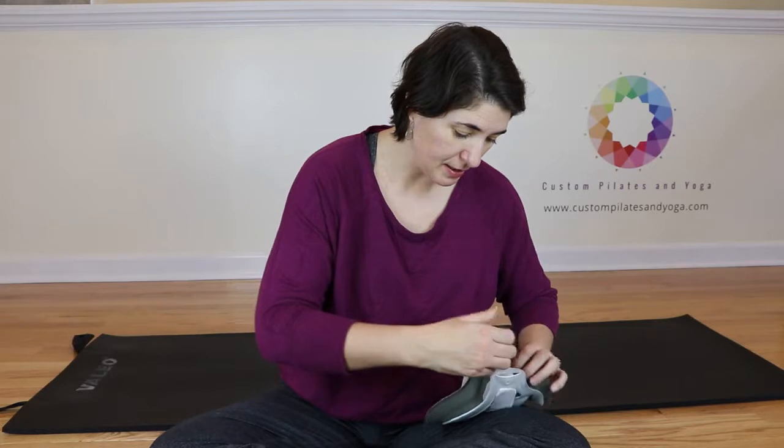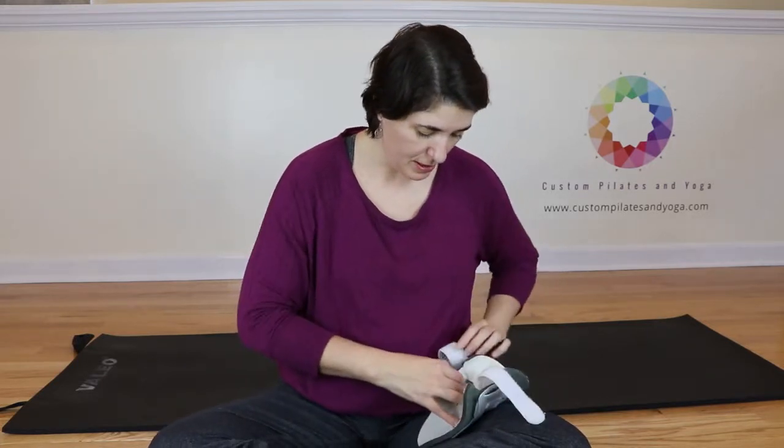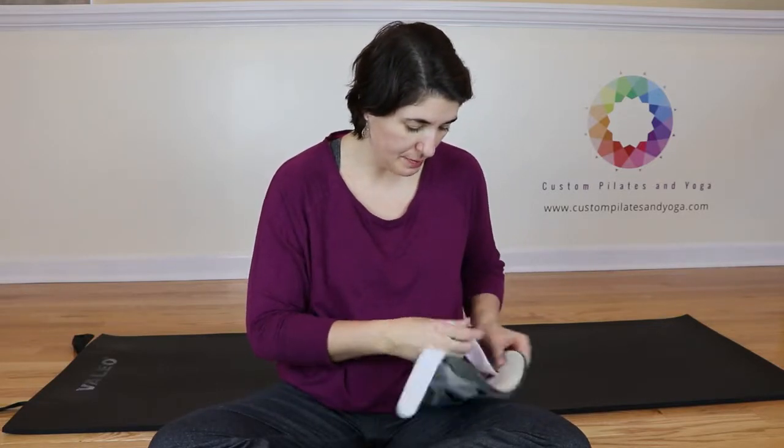You should pretty easily be able to loop your Velcro strap through on each side here because there's plenty of space.